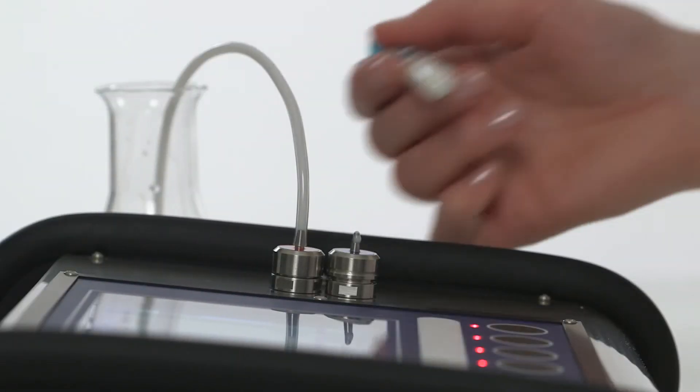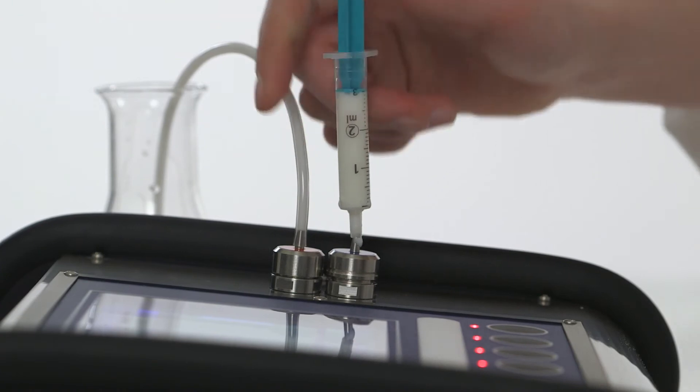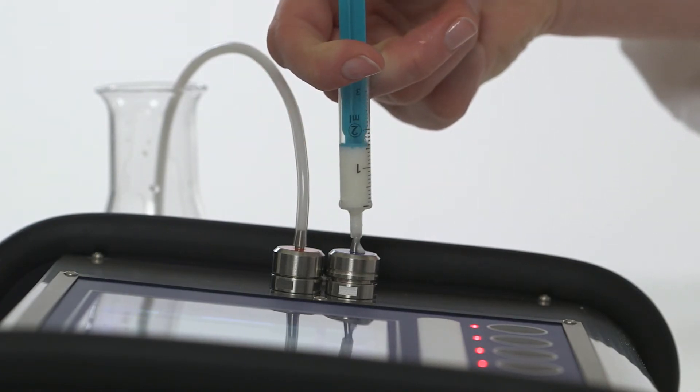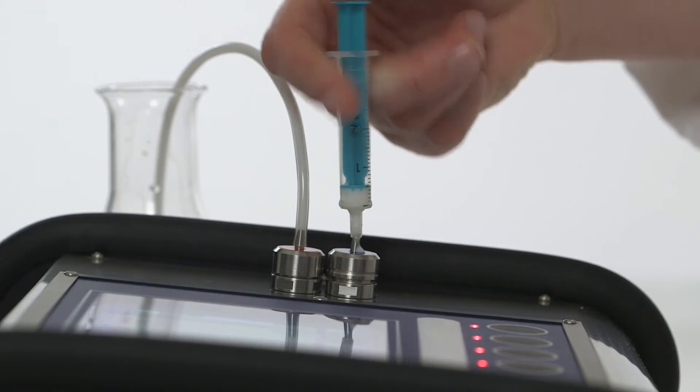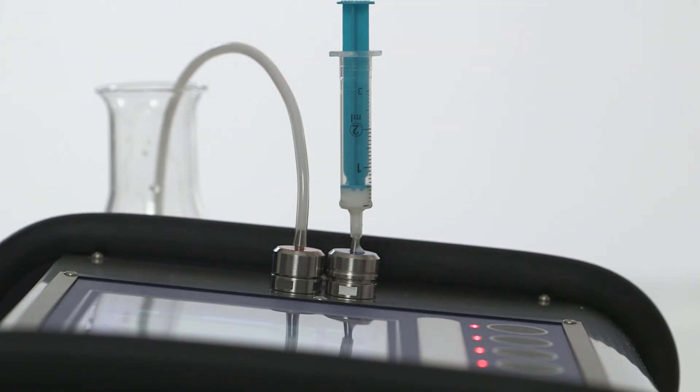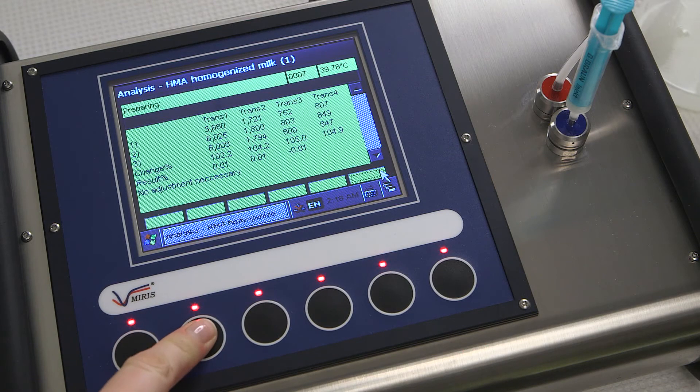To make a measurement, use a two milliliter syringe and inject at least one milliliter of sample into the blue inlet. Leave the syringe attached to the system. Press the start button.